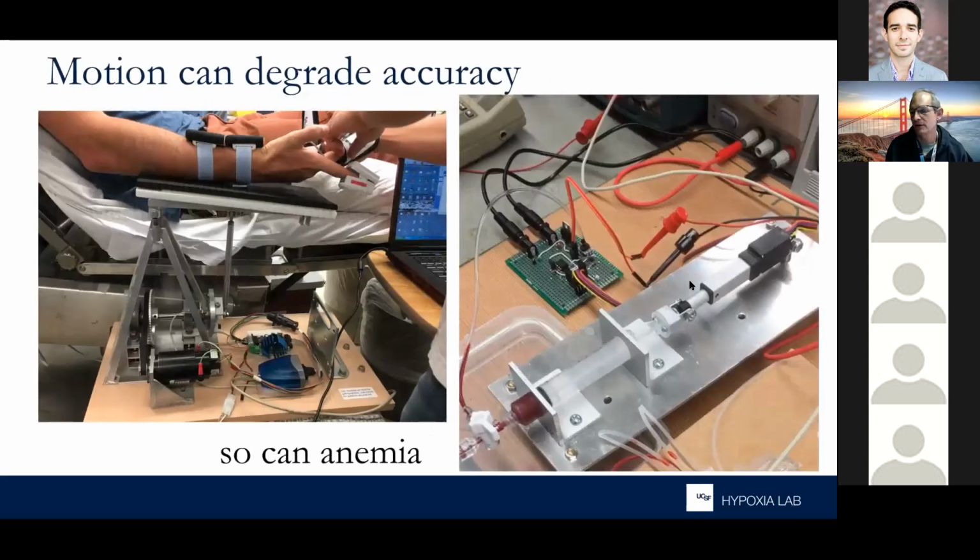Other factors that can affect performance include motion, so we have motion testing protocols, and anemia. The device at the right is something that Dr. Lipnick built to model anemia. Those are among the studies that are ongoing in our laboratory.